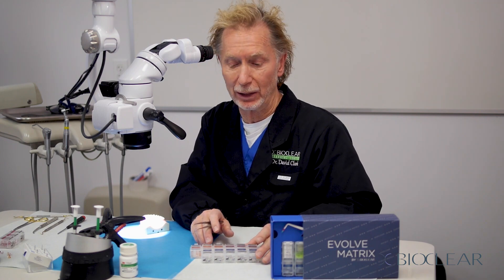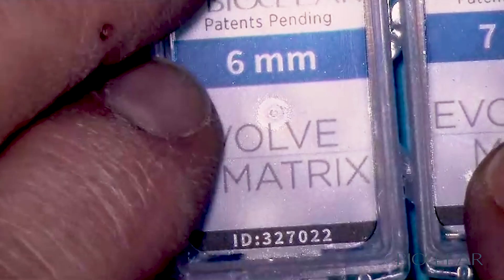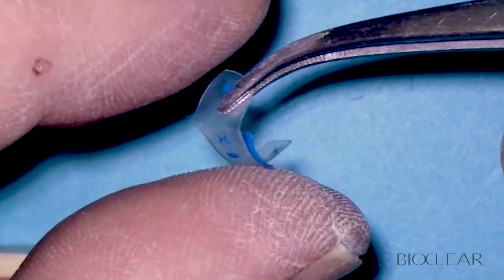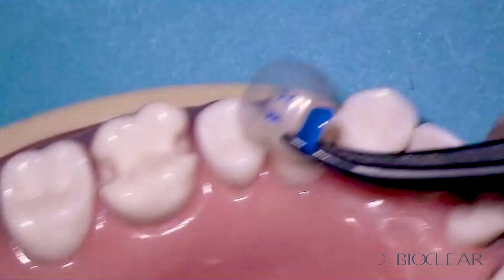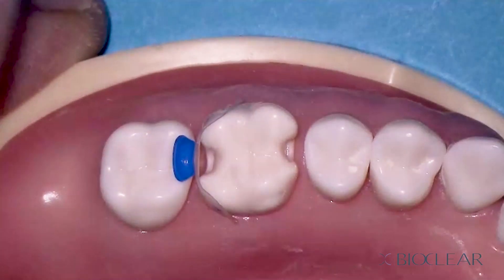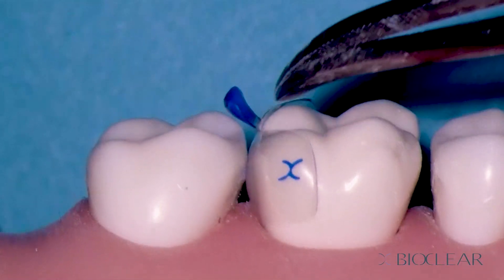My go-to matrix with the Evolve matrices is the blue. It has a significant amount of curvature, which we want most of the time. I'll grab one of the blue six millimeter matrices and seat that in there — it should be a nice fit. We rotate the matrix into position and drive it down. Looking from a side view, you can see the extension going below the gum line, the contact is right where we want it, and the marginal ridges are going to line up. That's an excellent choice. The blue Evolve is what I'll be using about 90% of the time.